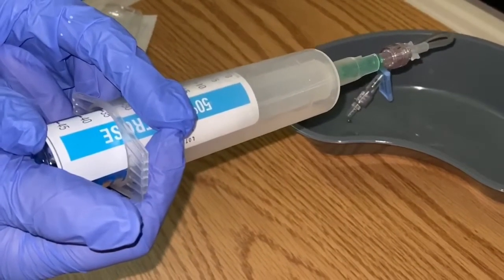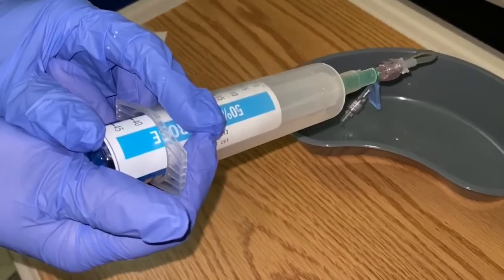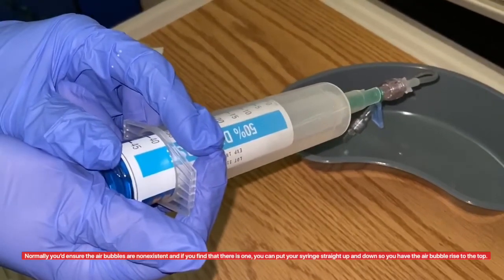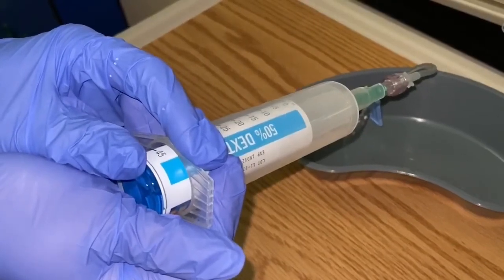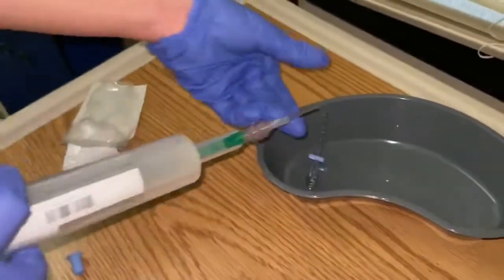Right here I don't have any air bubbles and it's not directly at a patient. I'm just trying to show you guys and demonstrate how difficult it may be to go ahead and inject this D50 solution and how viscous it is. That's pretty much it — let us know if you have any questions.